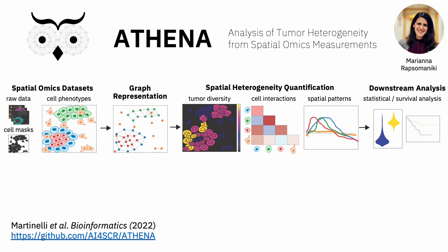This graph representation is then used as an input to our quantification module, where we quantify different aspects of that graph and the heterogeneity that we see in this graph. The quantifications resulting from this analysis can then be used by the user for further downstream tasks.